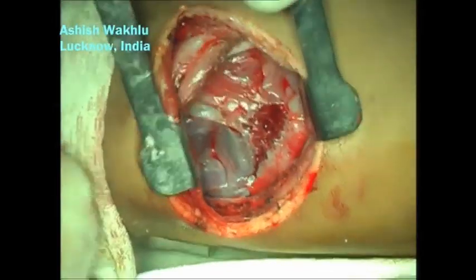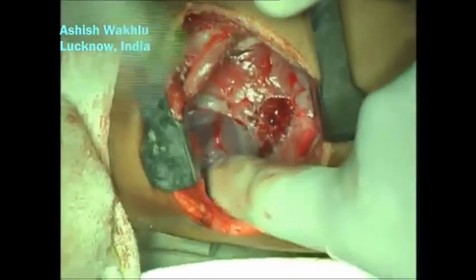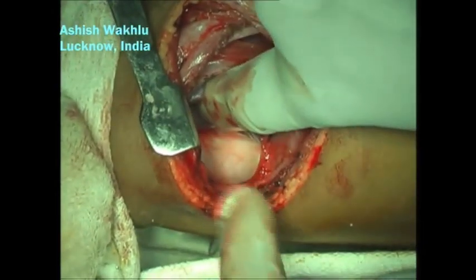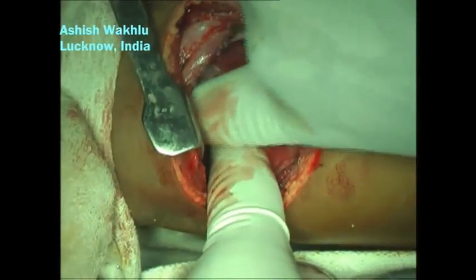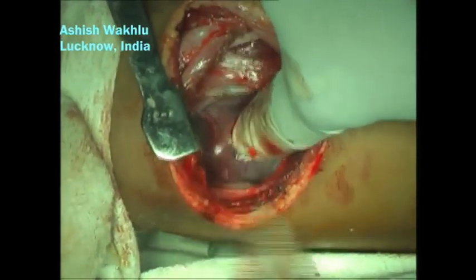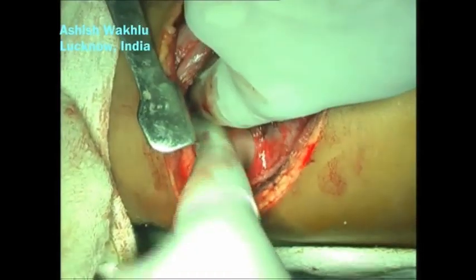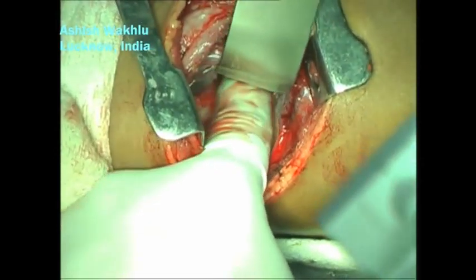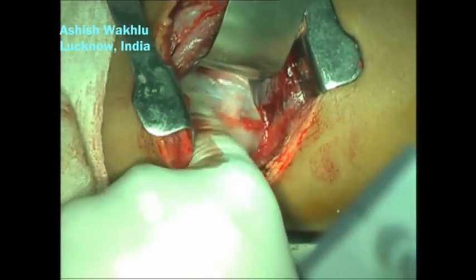By readjusting and opening the retractor a little wider, the exposure becomes a little better and it is possible to see the grey non-inflating lung on the right side. The lateral part has almost been freed up and we can see the lateral chest wall with the azygos vein beginning to come into view on the medial side.